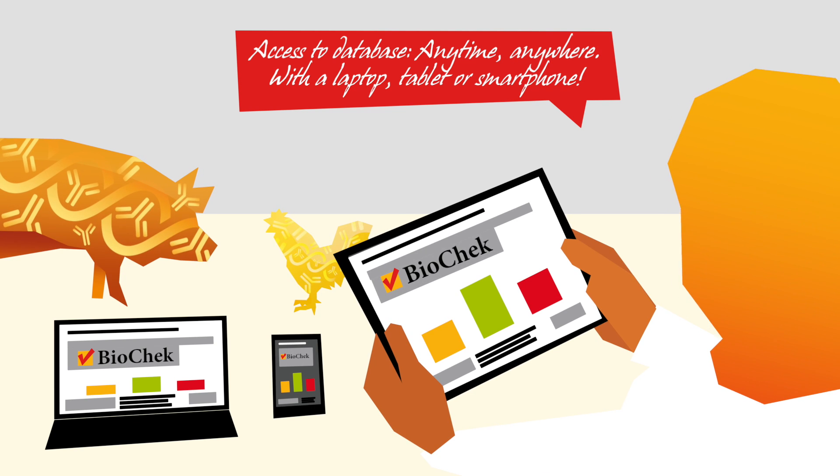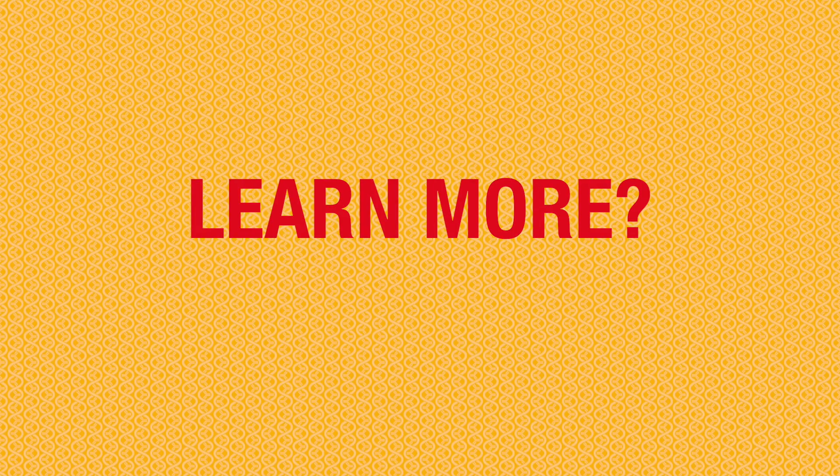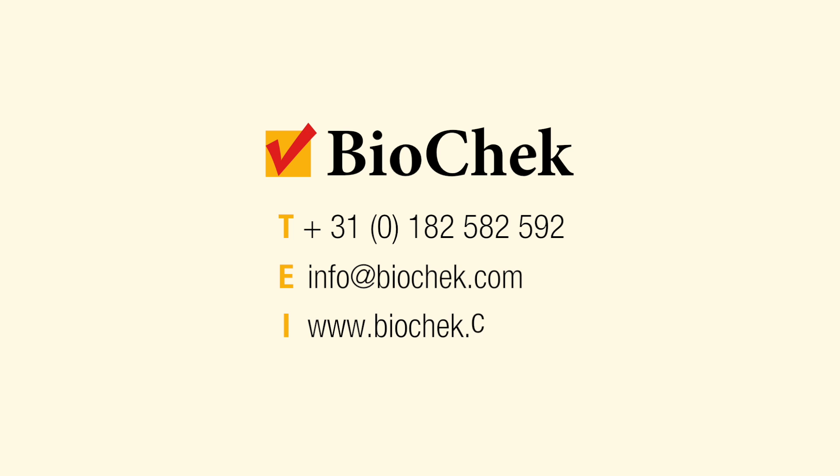BioChek Smart Veterinary Diagnostics has a lot to offer. Interested to learn even more? Then don't hesitate to contact us. For more info, biochek.com.